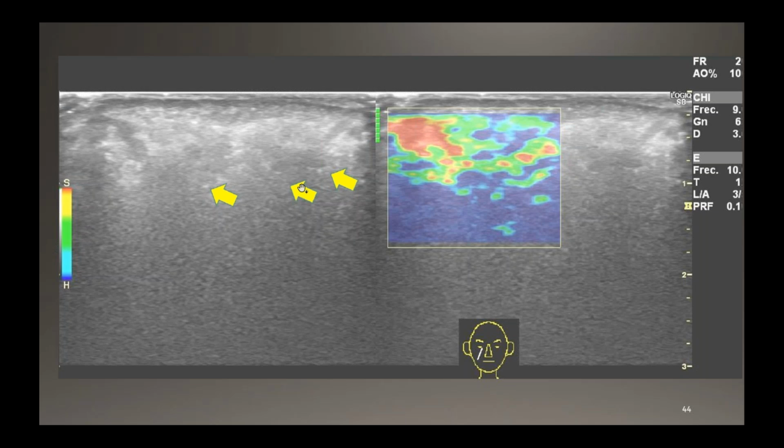They have at the base maybe silicone oil, and if she or he had an implant in the 90s, they would have had polyacrylamide, and in the early 2000s hyaluronic acid, and you can see, like earth strata, how these deposits can be located.